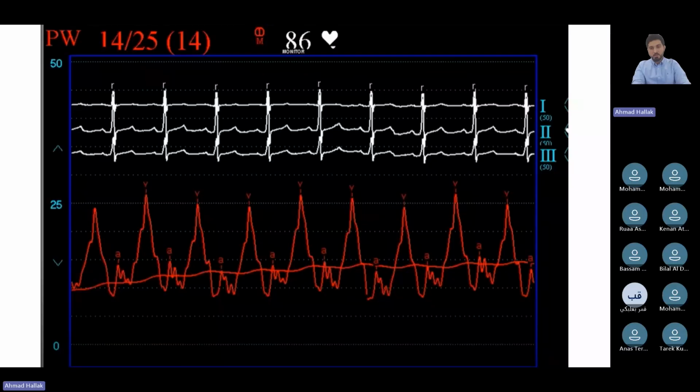Because it's not necessarily, you can put 2 clips and have no change in your mitral regurgitation severity. So evaluating the V wave before the MitraClip and after the MitraClip, the transcatheter mitral valve repair, will tell you. A lot of times you can have the wedge pressure in, and you can say, okay, you put in the clip, the V wave went down from 25 to 15, and from that, you can say, okay, that was a good clip position. Otherwise, if you have no change, then you can always remove the clip and put it somewhere else.